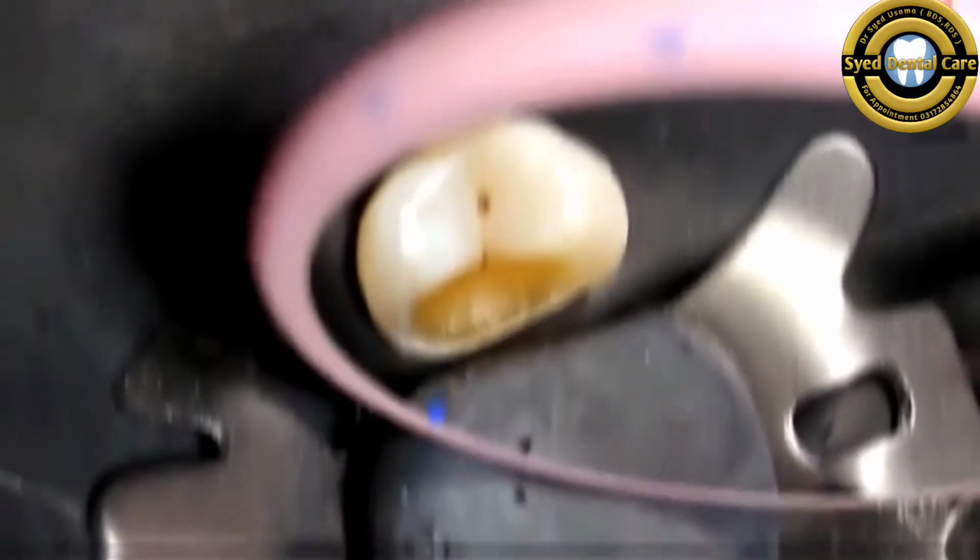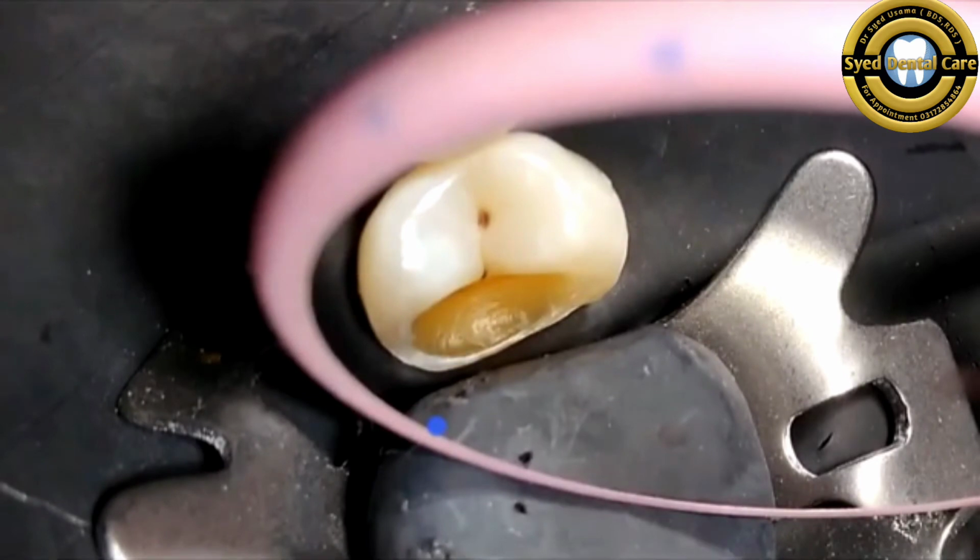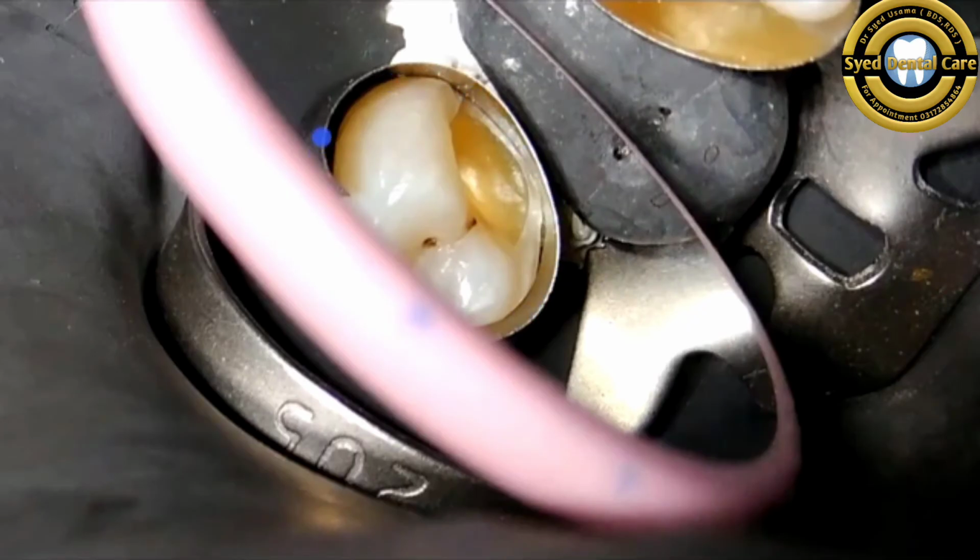Proceeding further, after isolation was done, we carefully excavated the lesion, keeping in mind that we have to preserve healthy tooth substrate, that is, healthy enamel and dentine, but we have to remove all the decayed and unsupported tooth structure. Here you can see a simple matrix band was placed and adapted to the tooth surface with the help of a wooden wedge. The next step is enamel etching.